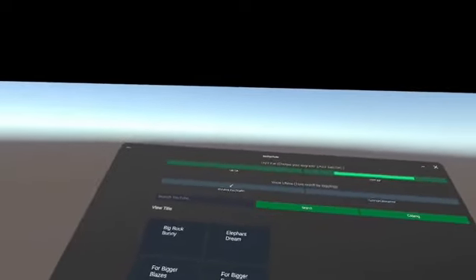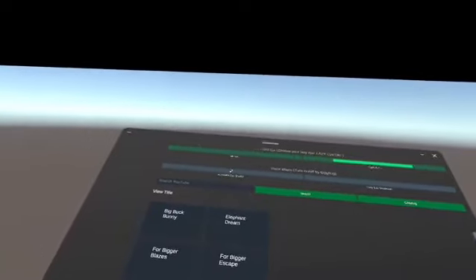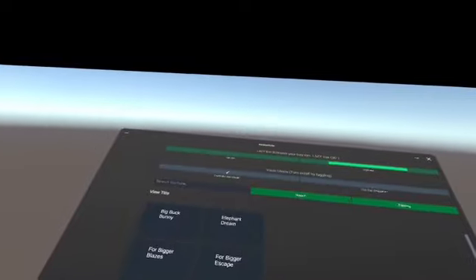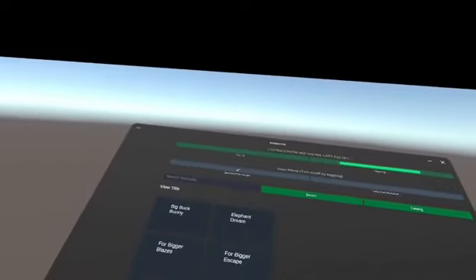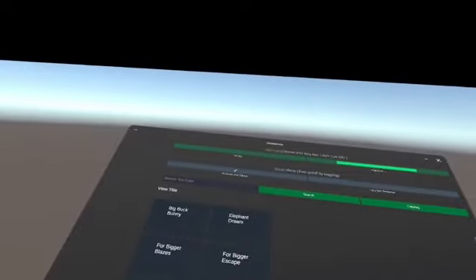You can selectively sharpen the objects or shade the objects as per your need, okay. So the environments are easier to make, and they are not very static environments. It is very good for your neuroplasticity, because the problem with the brain is that it gets used to a static environment which doesn't change, and then the therapy stops working. But if you keep on changing your environment, then the therapy keeps on working.